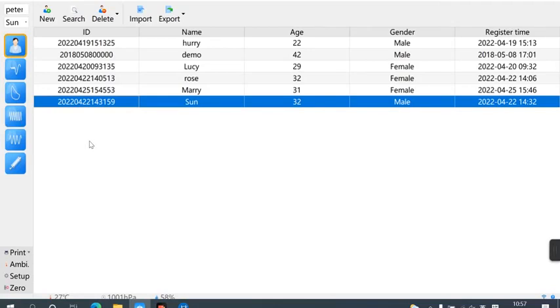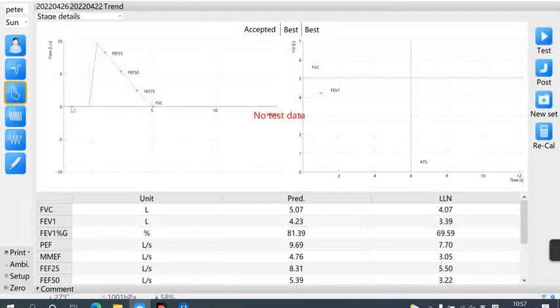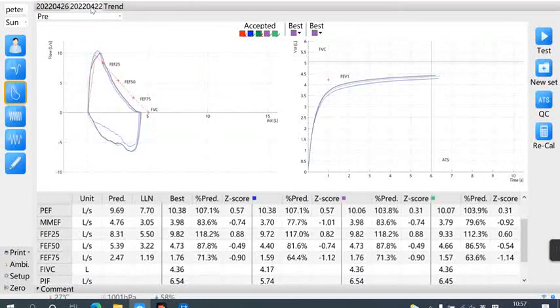If necessary, change the diagnostic results of the historical report. Click Test Mode and wait for zero calibration. Click the test record in the upper left corner, and then click the comment in the lower left corner.